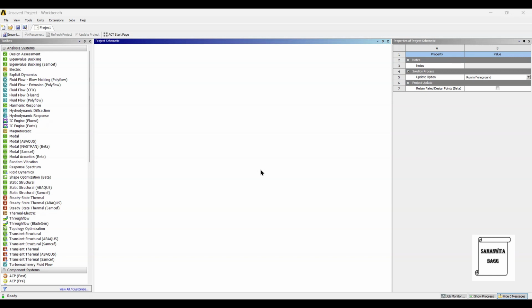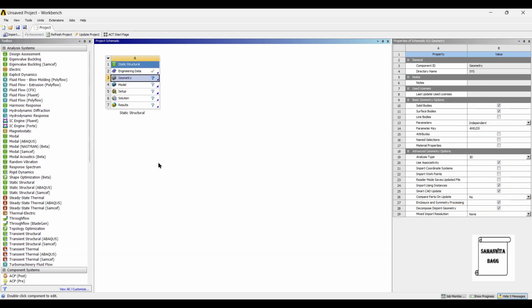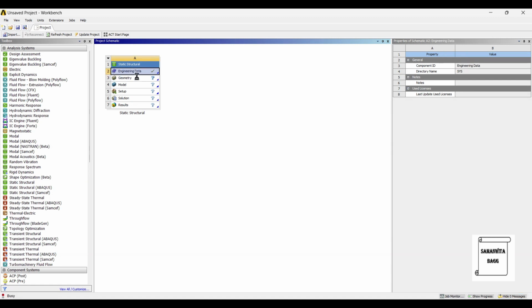In this session, we are going to analyze the compression bone plate for its static structure analysis. We will start by double clicking on static structural. First, we will go to engineering data.